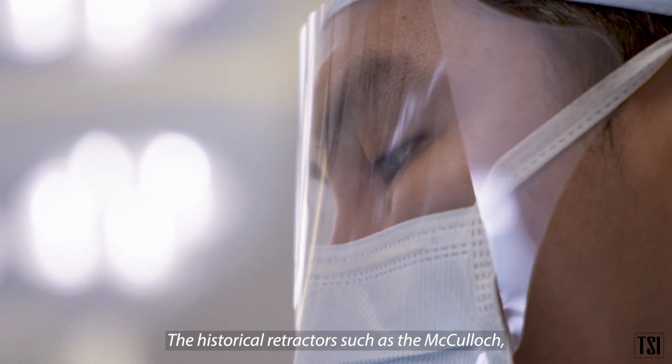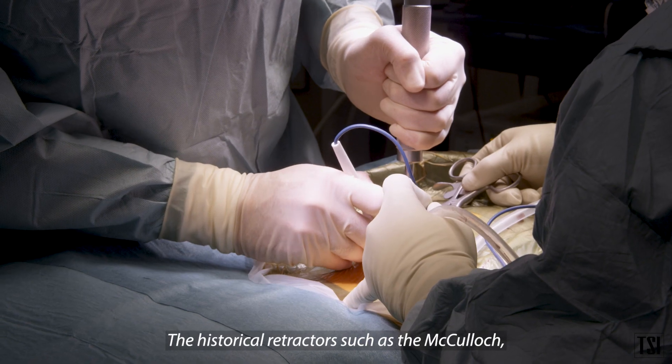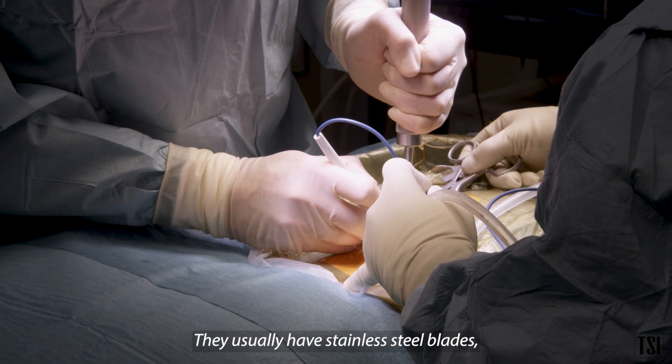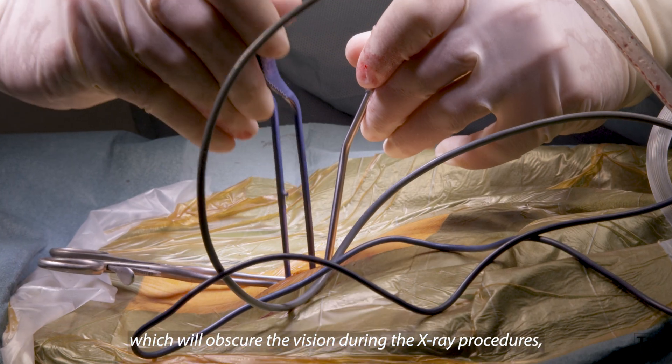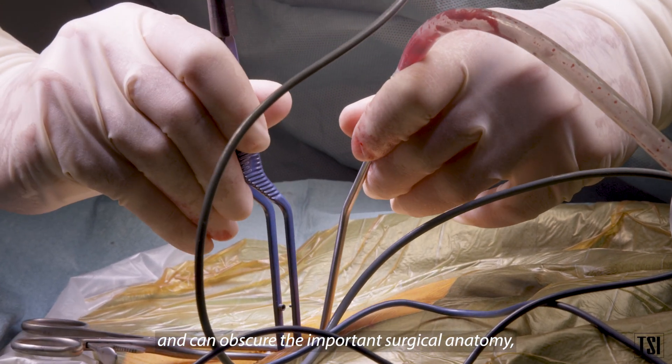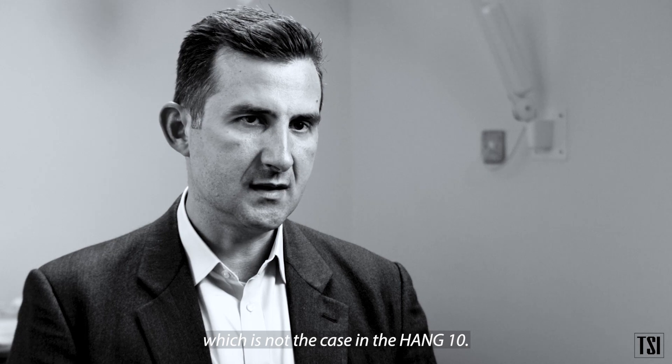Historical retractors such as the McCulloch, which is the most common on the market, usually have stainless steel blades that obscure vision during x-ray procedures and can obscure important surgical anatomy — which is not the case with the HANG 10.